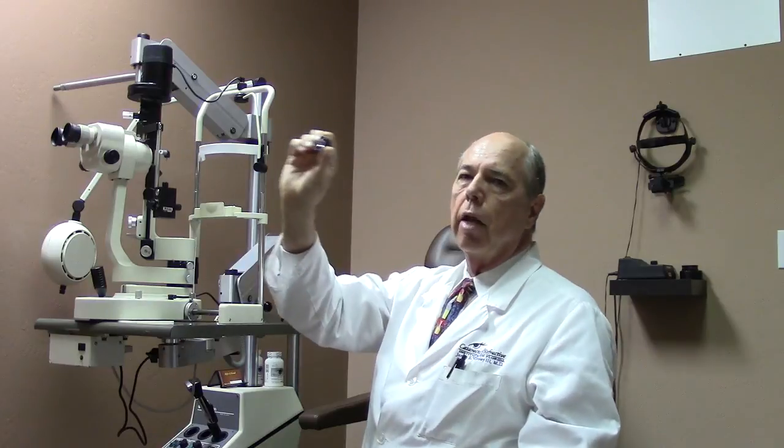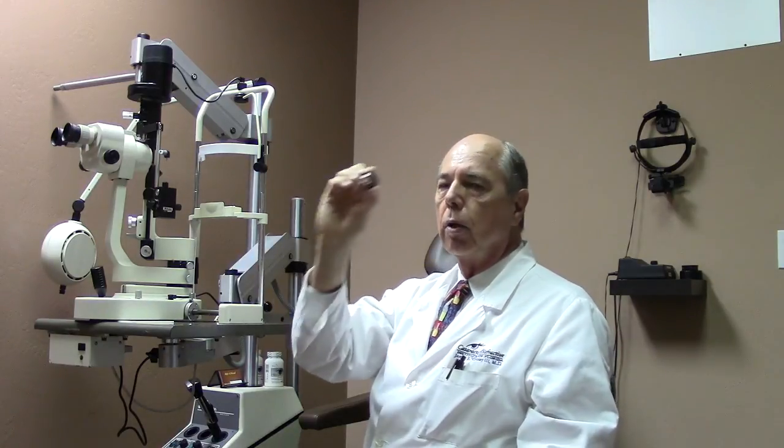We can also look in the back of the eye through the pupil — we can dilate your pupil, look through it, and hold a lens in front of the light to examine your retina in very high detail. There are different sizes and shapes of lenses that we use, which give us different magnifications and fields of view depending on the type of lens.